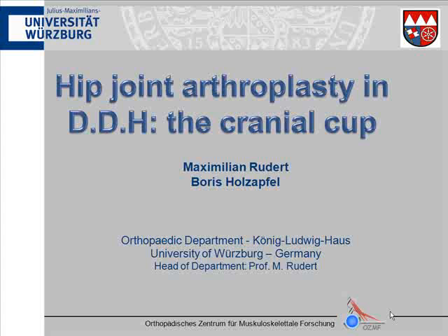But what I want to stress is, if you think about CDH and especially about hip arthroplasty in CDH, never forget that you also have a significant amount of anteversion of the femoral neck. This is from a book from Putti, from Italy, which is increasing with age.